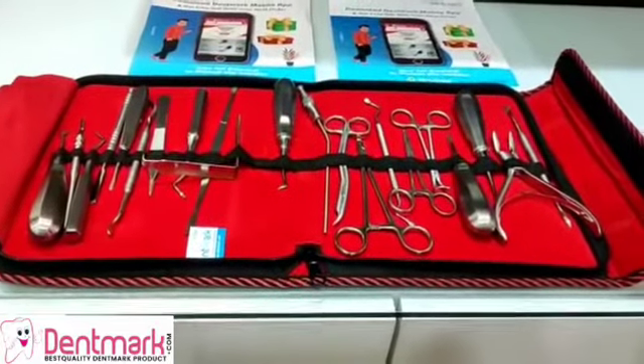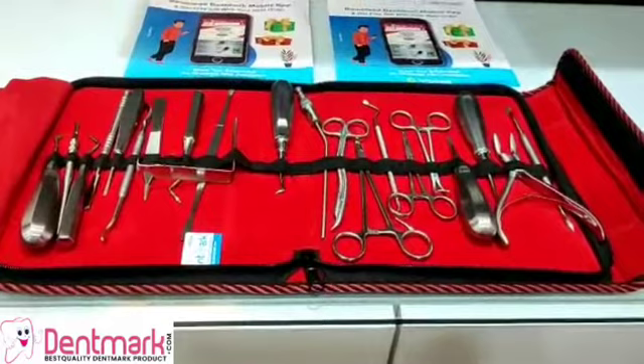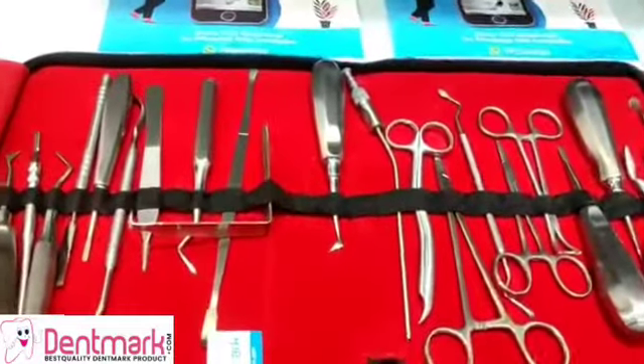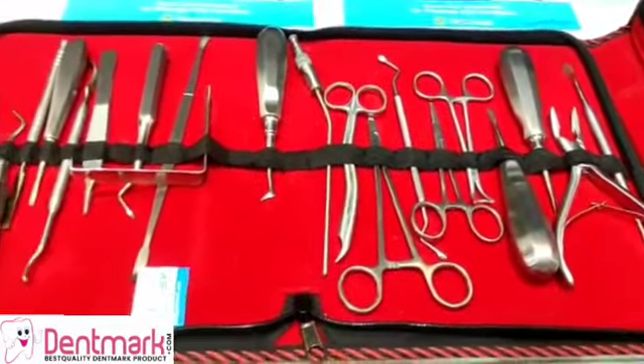Scalpel, retractor, forceps for tissues, needle holder, rongeur, scalpel handle round, periosteal elevator, Molt number 9, bone file miller, cold chisel, osteotome chisel.